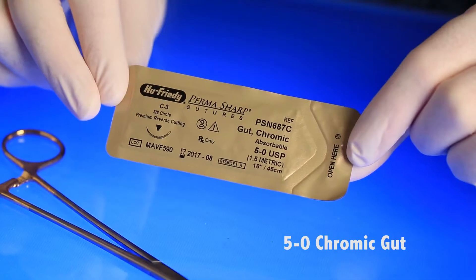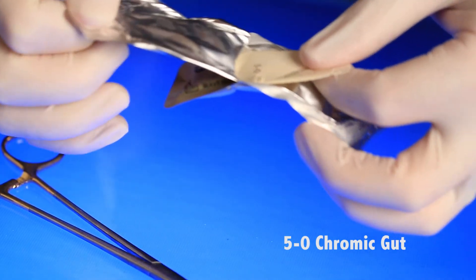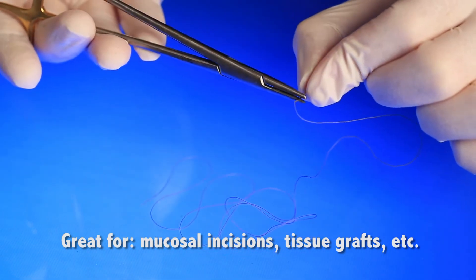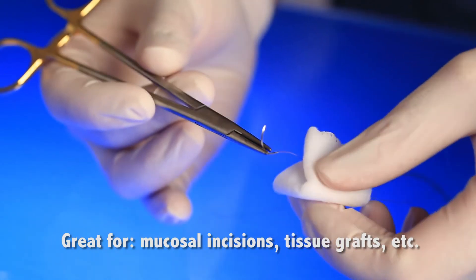5-0 Chromic gut is the third essential for your suture drawer. You will love this suture for closing incisions in mucosa, all-around suturing around smaller extraction sockets, suturing where contacts are tight, and reinforcing crestal closure. The Hu-Friedy 5-0 Chromic gut comes with a P3 needle which has a smaller circumference and is perfect for closing vertical incisions — it passes atraumatically through any delicate tissue. I really like using 5-0 Chromic for areas like alveolar mucosa where I don't want to retrieve the suture or where using a longer-lasting suture may irritate the tissue.